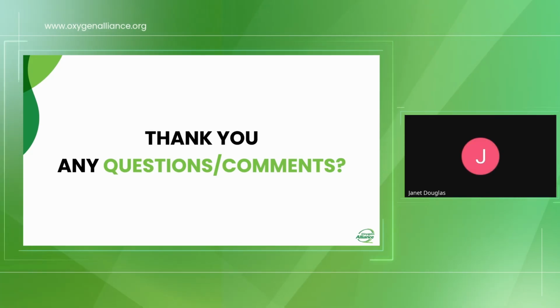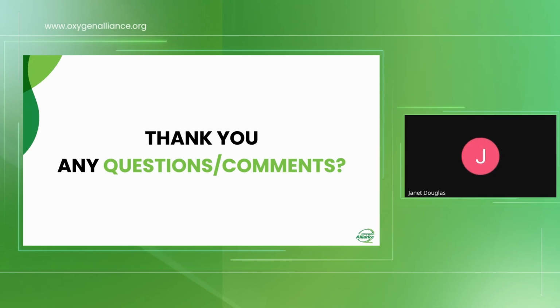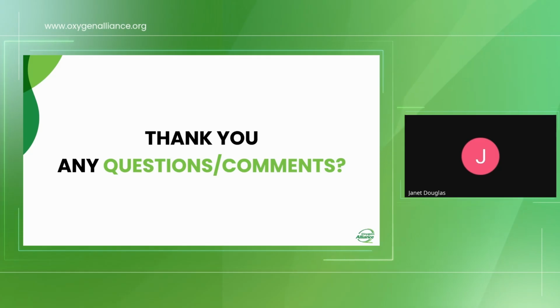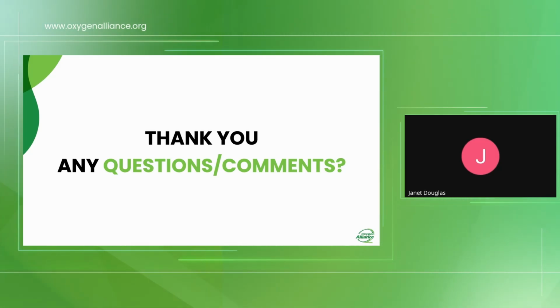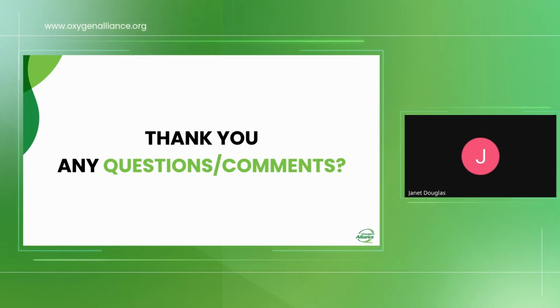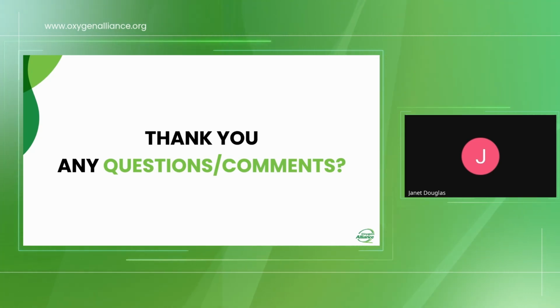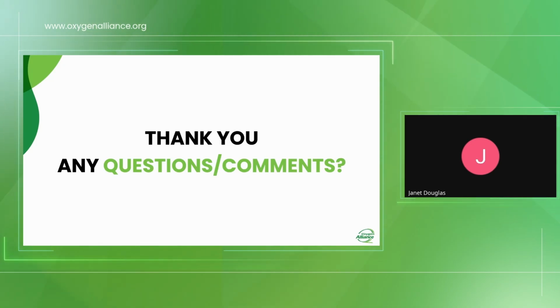All right. So normally you're supposed to be doing it annually, but some calibrations are device specific. If you check some models of patient monitors, they will specify in the service manual that you should be doing it annually or twice every year. I'll give an example. There is a certain model of TELUS where they specify that you do it once every 2 years. So that's the time that you're supposed to do the calibrations.